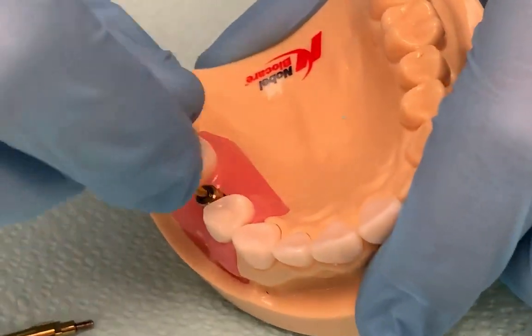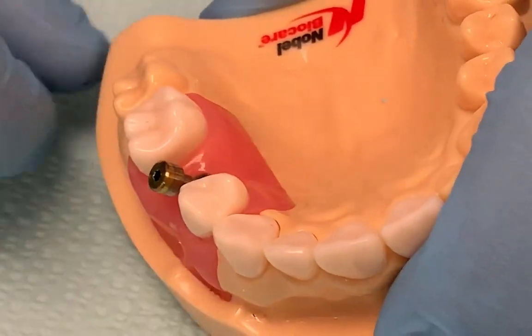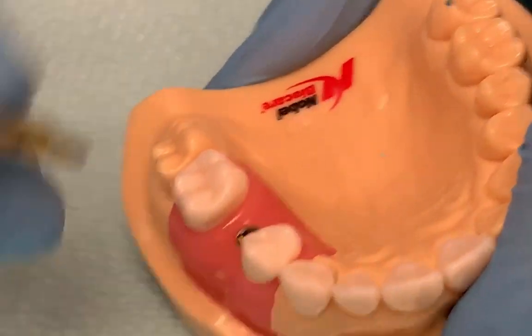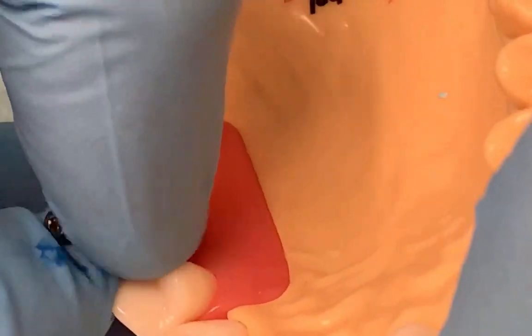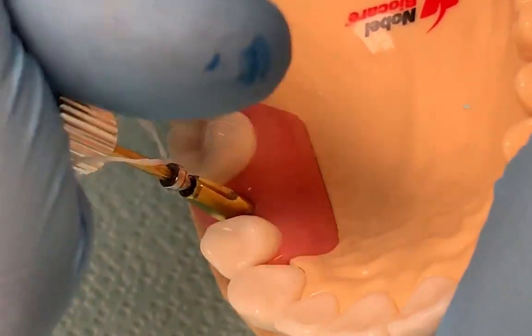So we're going to remove the healing abutment and place in the transfer impression coping. And when you place it, you have to make sure that the ridges line up and you tighten that.